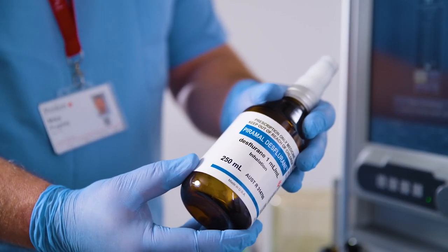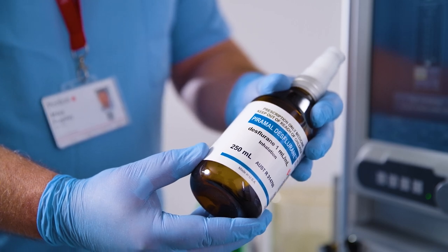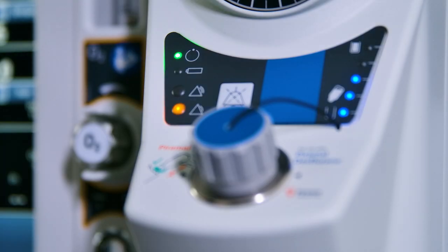If filling the vaporizer during a clinical procedure, check that the agent bottle is at room temperature, and do not refill if mains power has failed and the backup battery is in use. Start the filling procedure.